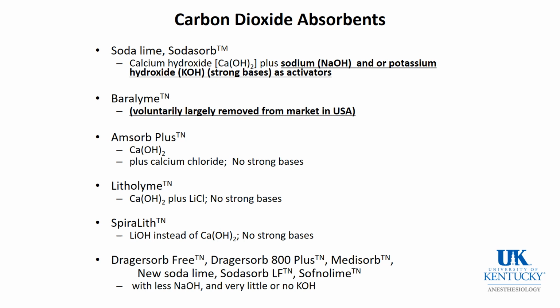The problem with soda lime is it produces strong bases, and these are the causes of some of the fires that are seen with overuse of soda lime, and also some of the chemical activities that cause abnormalities with inhalation agents.